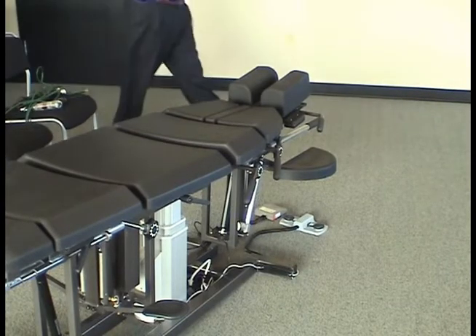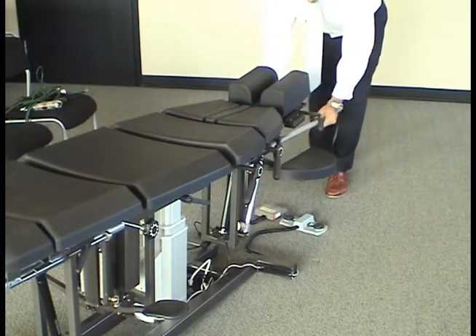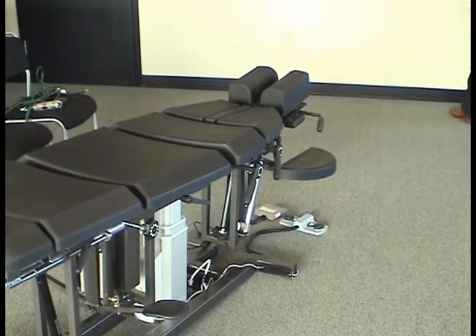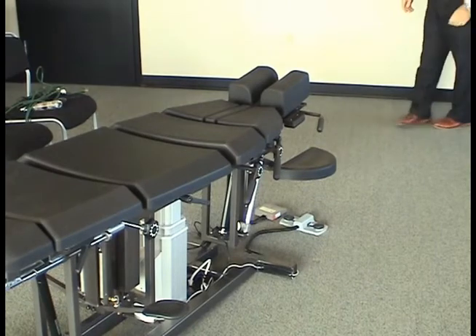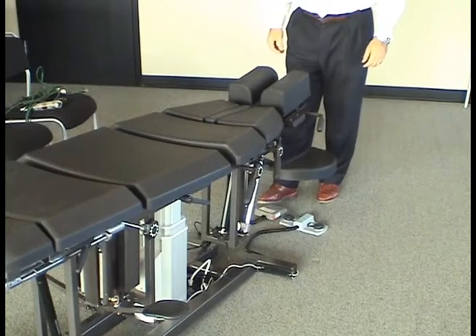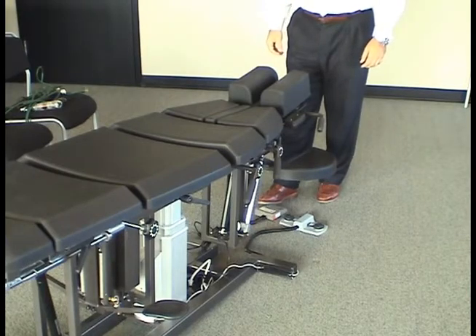Remember to remove the lift rods before plugging in the electric headpiece motor. The headpiece motor foot switch is commonly placed on the floor underneath but slightly in front of the headpiece mechanism. It is advisable to tape the cord to the floor, but please leave enough cord slack to allow the headpiece to go into complete elevation.